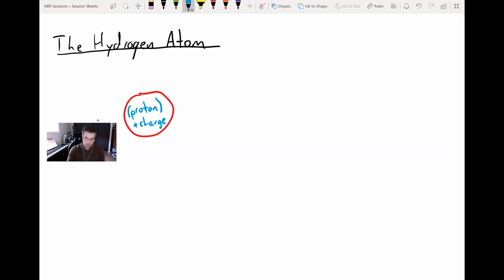And that can be represented with field lines. If you're not too familiar with field lines or what magnetic fields look like, don't worry, it doesn't really matter that much. I'm just going to draw some on here to represent that this thing is generating a magnetic field. So I'm going to draw one with an orientation that's slightly oblique. We'll just have a tangential one, and same thing on the other side.